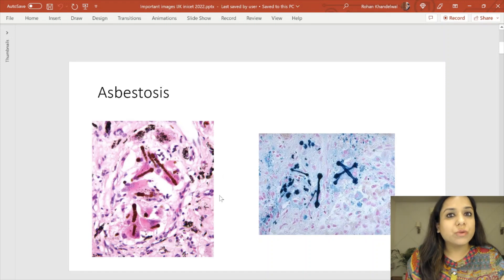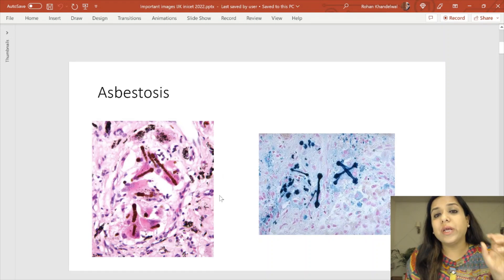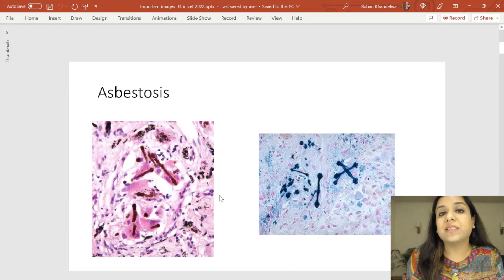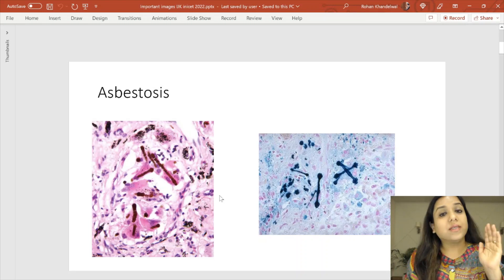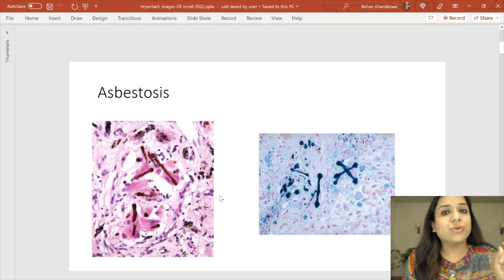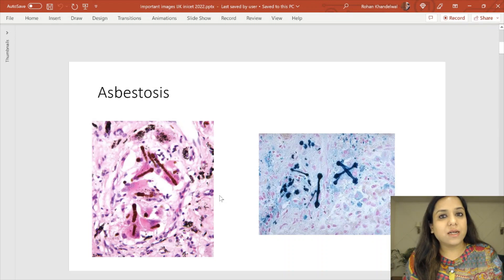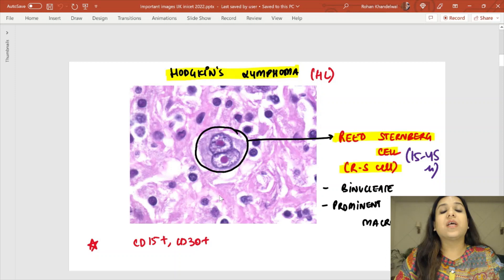Also important: in the first image on the left side, you can see a blackish pigment. In a lung biopsy, this blackish pigment is basically anthracosis — carbon pigment. There was another question on carbon pigment asked last year in the NEET and INICET exam.